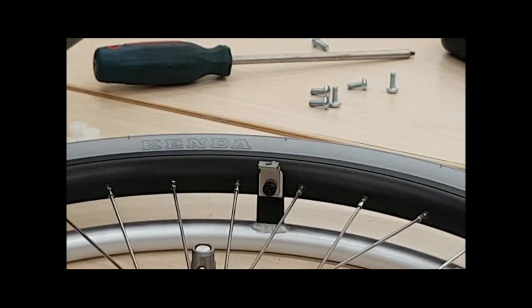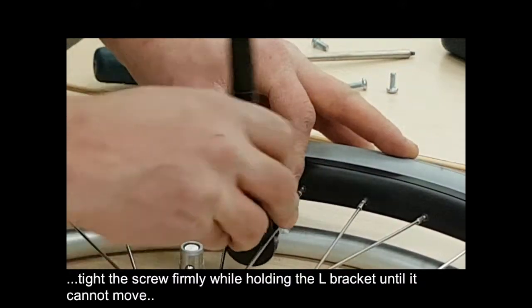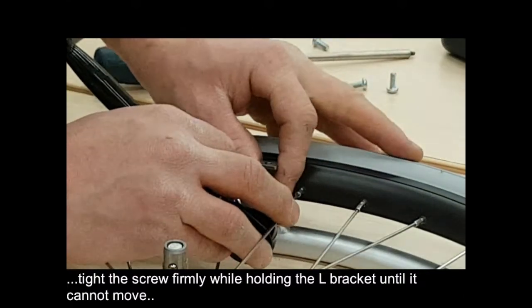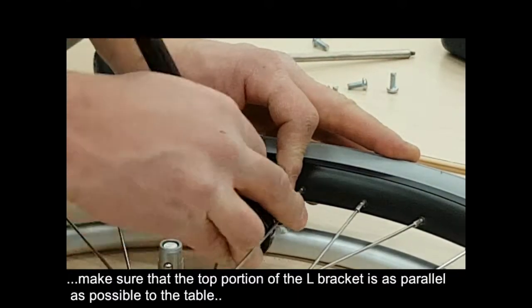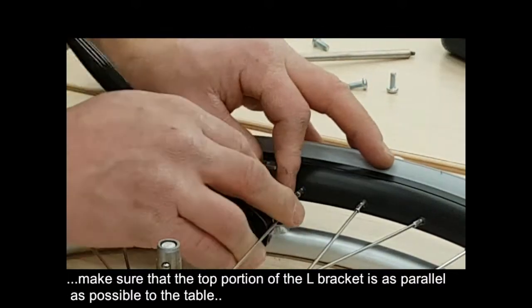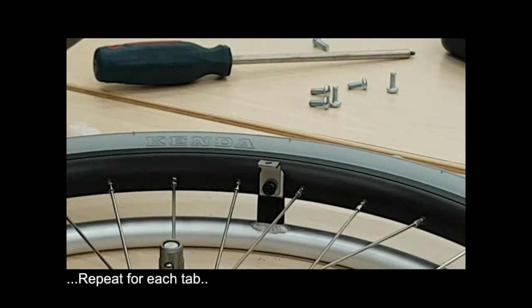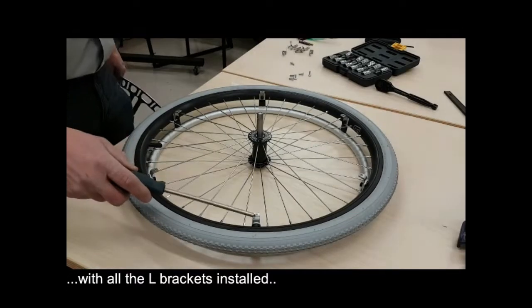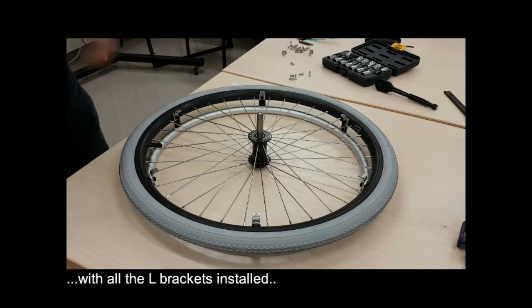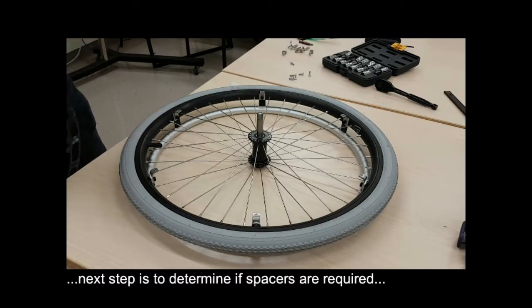So once you've done this, you tighten it in place, making sure to hold it so that it will remain as straight, or as parallel to the table, as possible, okay, this way, good. And we repeat the same thing on the 6 or 4 attachments for the Handrims. Now that we did install all the brackets on each and every attachment point of the tabs or the Handrims, we need to choose whether or not we are going to be using some spacers.